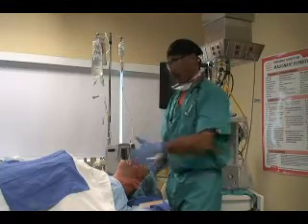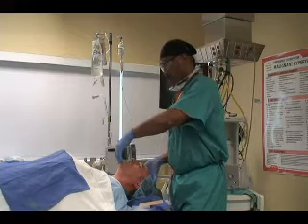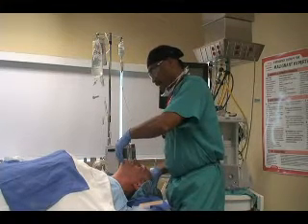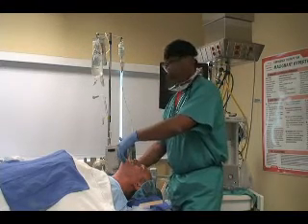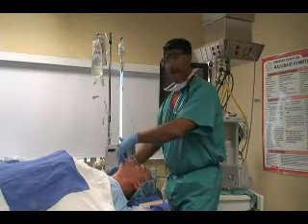head tilt chin lift. With a head tilt chin lift, I'm going to place my fingers on the mandible, lift the head back a little bit, and I'm going to open his airway. That way it'll provide maximum opening of the airway, moving that soft tissue to open the airway.